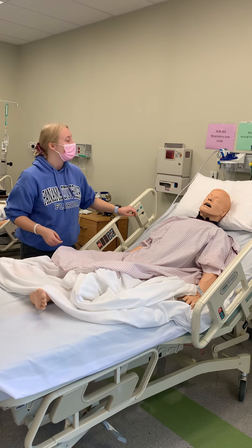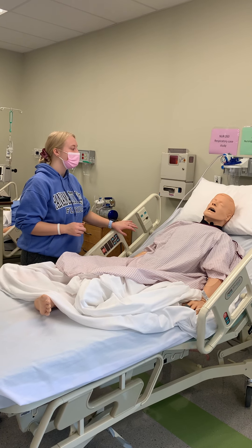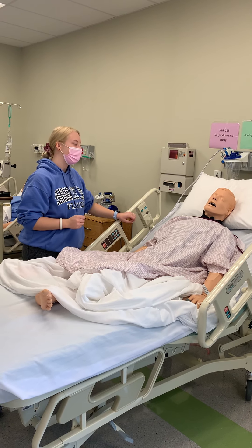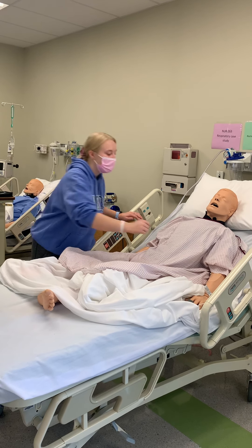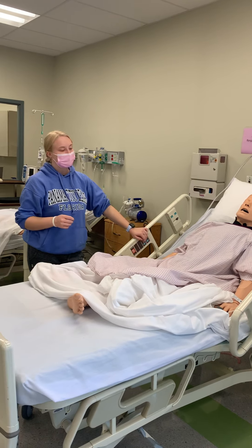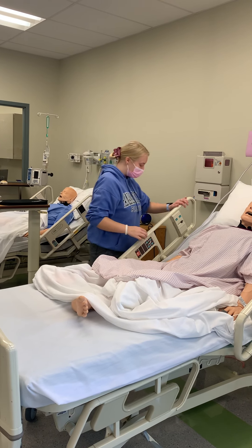I'm just going to be here to put a catheter in for you. Can you tell me when the last time you went to the bathroom was? Okay. Are you having any pain? Any questions for me? No? Okay. I'm just going to verify your name and date of birth for me. Can you say that for me? All right. Perfect. Okay. I'm just going to go ahead and get my equipment set up and then we'll get right to it.